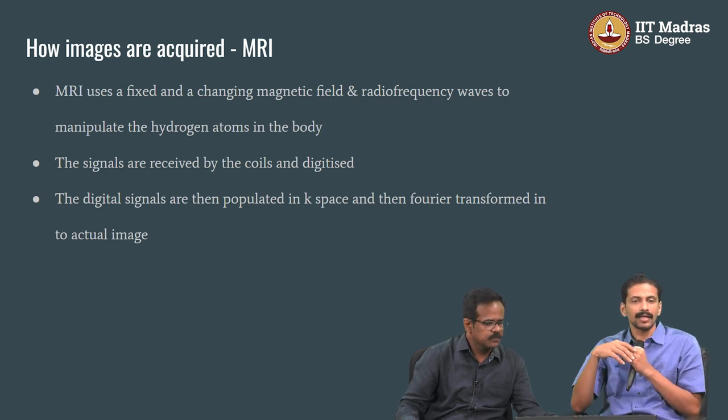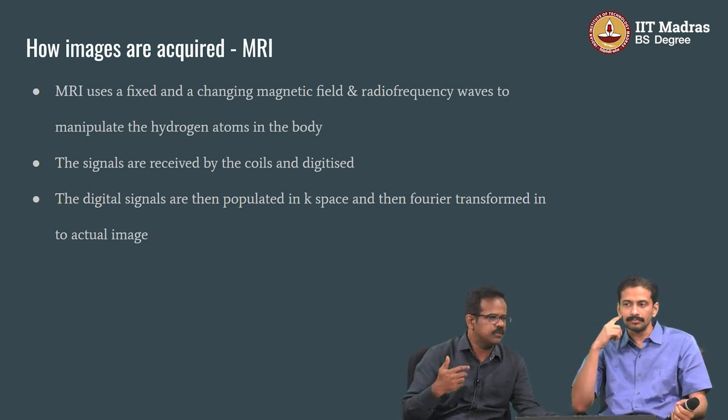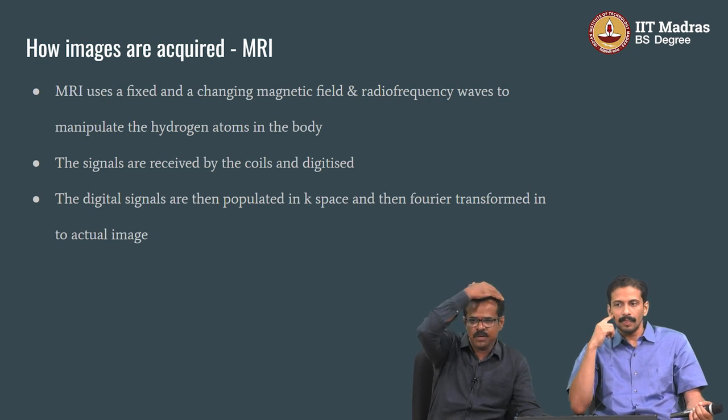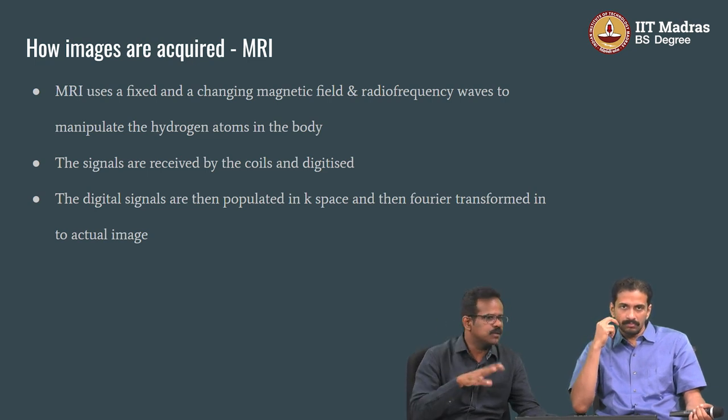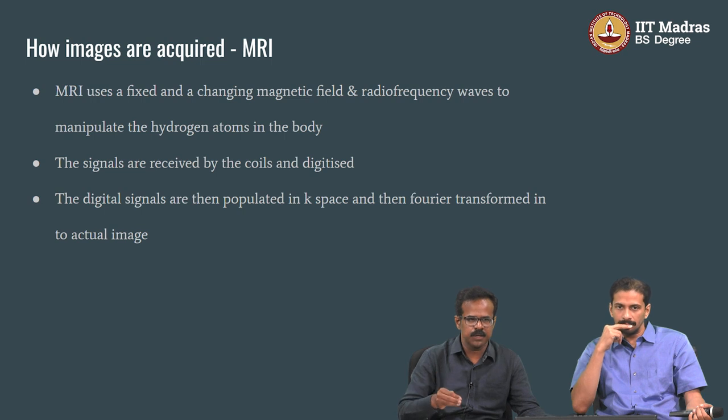Especially for my field, neuro, the brain is inside a hard skull. You can't put an ultrasound inside it. Even X-ray is not useful. But this MRI is very, very helpful. Without MRI, neuroradiology doesn't exist to see inside the brain. Not only anatomy, even some of the functions.